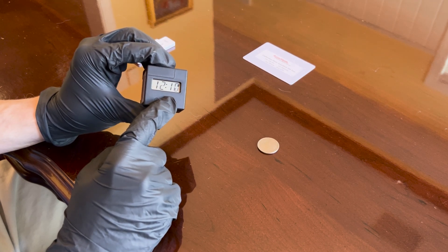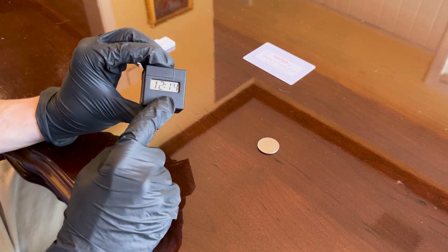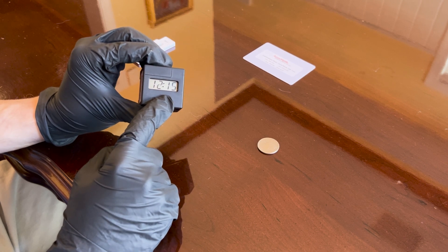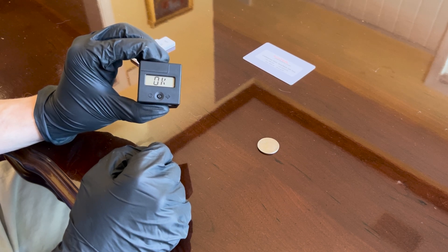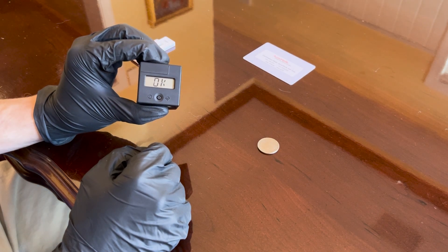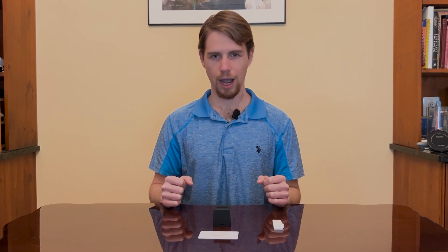Scroll through and set the hours and minutes for the current time. Once you've made your minute selection, the date and time will have been successfully stored in the black box device and you will see the display show the word 'okay.' Now that the black box reader is turned on, let's go over how to perform an immediate reading.